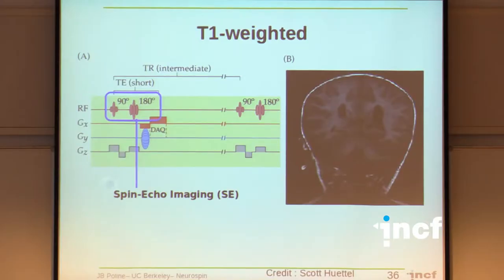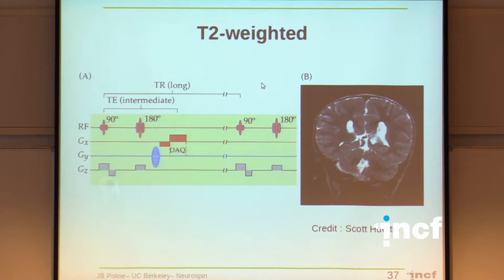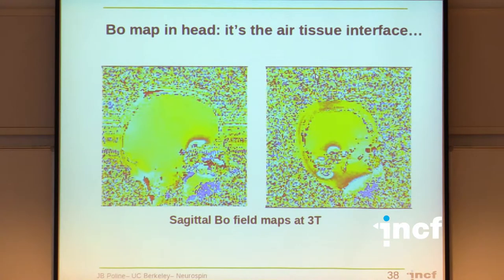Basically, using those tools, you can look at the anatomy of the brain, gray and white matter, and skull, and that's the T1 weighted. Then we're going to functional MRI. We're going to use T2 weighted images, and I'm not going into why, but that's another contrast. T2 weighted can also work very well for anatomical images, right? But for functional MRI, it's the one we're going to use.